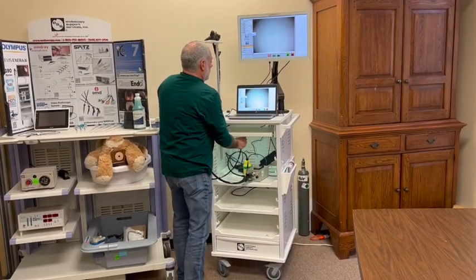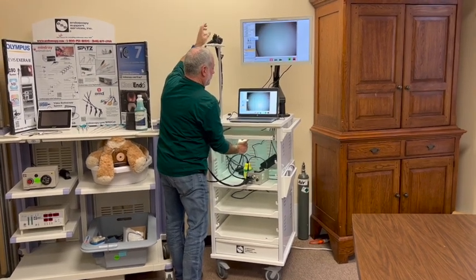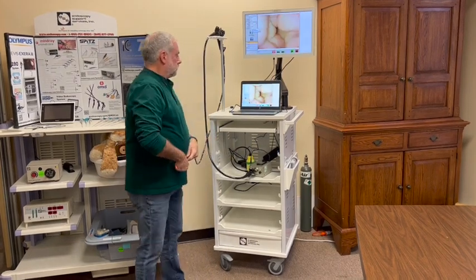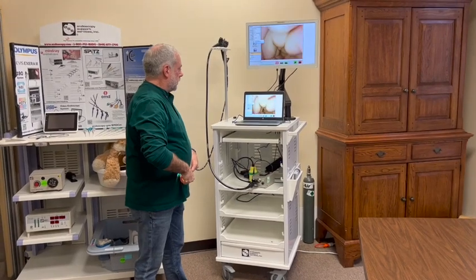First thing I want to do is set the color by doing what's called a white balance. I'll hold it to something white, hit the button here to set the white balance, which sets the color for my scope. Now I'm ready to go. Everything's automatic — the light intensity automatically adjusts as I go in and out.